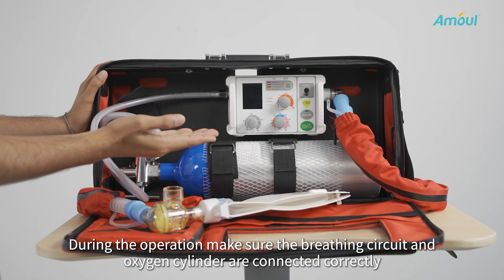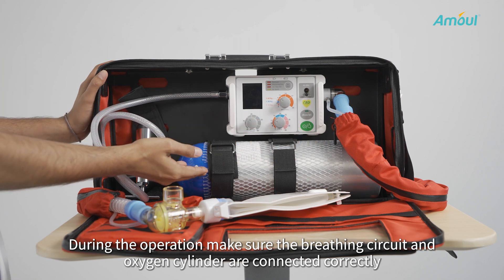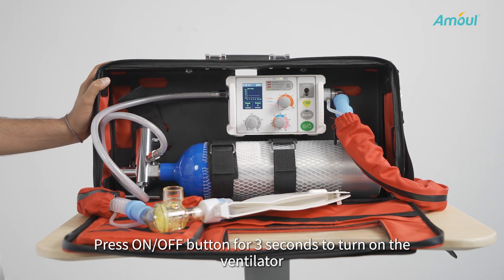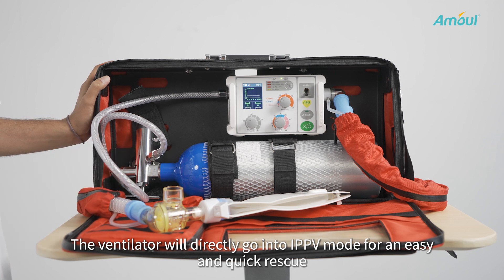During the operation, make sure the breathing circuit and the O2 are correctly connected. Press the ON-OFF button for three seconds to turn on the ventilator. The ventilator will directly go into IPPV mode for an easy and quick rescue.